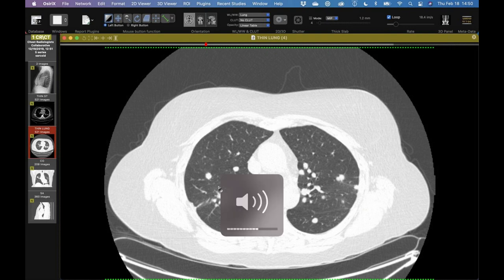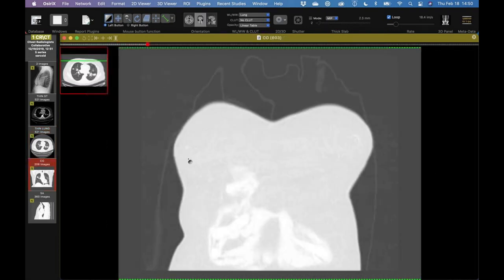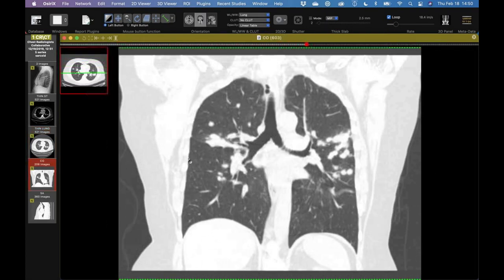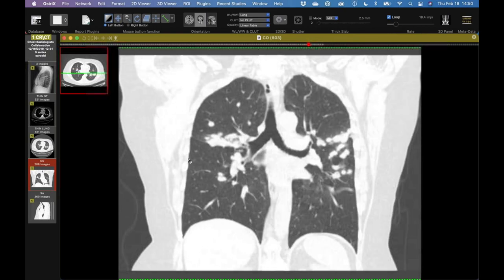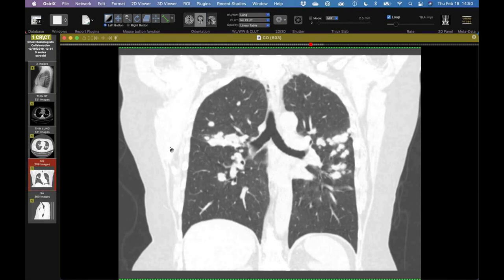It's on my list of things that can radiate up from the hila in that flame-like distribution — classically Kaposi sarcoma, but also lymphoma and sarcoid. A little bit of that flame-like radiation from the hila going on here. But each individual nodule almost looks more like a hematogenous metastasis than your typical sarcoid nodule. Sarcoid with really large perilymphatic nodules — has anyone else ever seen this pattern?